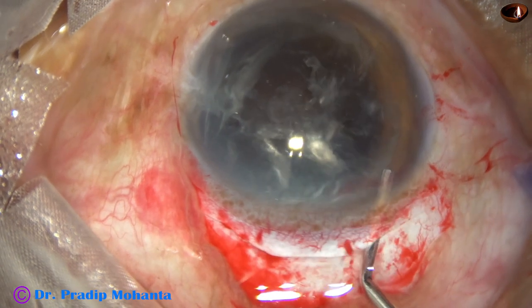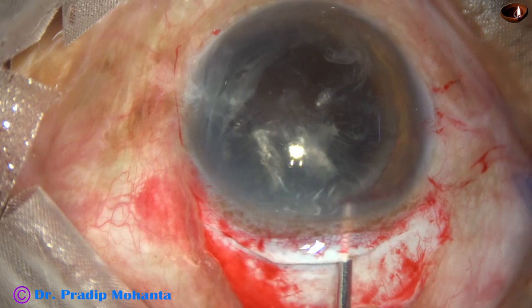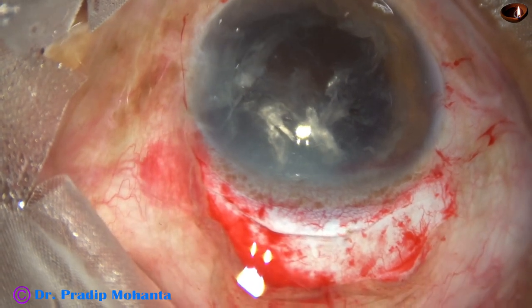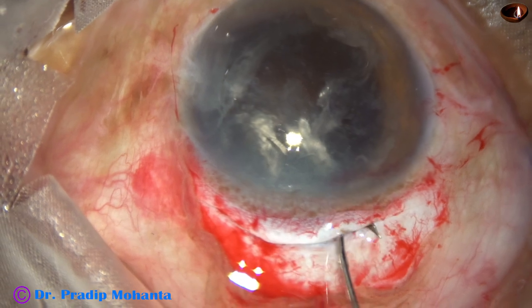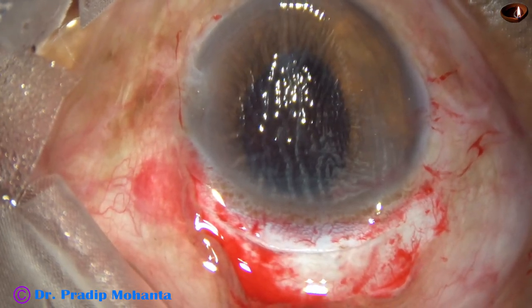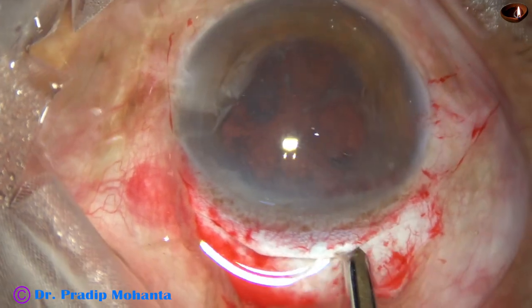It should not rub the cornea. So inject some visco between the cornea and the nucleus. Inject some visco behind the nucleus and use this fish hook to deliver this nucleus. See how easily it comes, because the wound is large, about 9 or 9.5 millimeter.